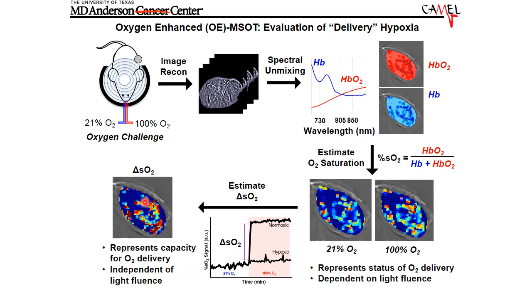So we can measure delta SO2. And this is challenging to interpret, but our interpretation is that this is showing how much more oxygen gas or oxygen capacity is available in a tumor. It's as if you're driving down the road and you look at your gas tank and you can see that your tank is only 1/4 full. Well, it's also 3/4 empty. You have 3/4 of that tank that have capacity for more gas. So this is showing us that if we were to flood the tumor with as much oxygen as possible, 100% O2 carrier gas, what is the capacity to take up more oxygen?